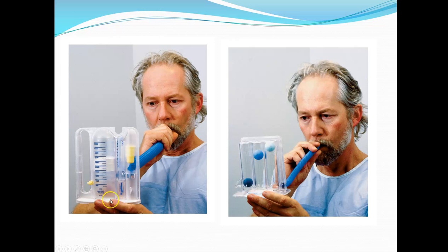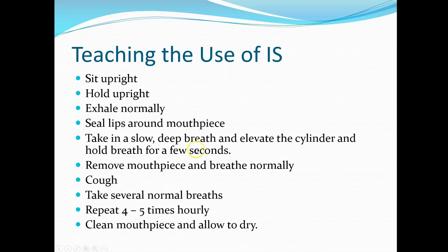We'll have a goal for them on how much volume in milliliters we want them to be able to breathe in. We'll see how they do, and we'll document how many breaths they took in and what volume they were able to take in. Okay. And a lot of patients will want to blow on it, but they're taking in a big, deep breath.